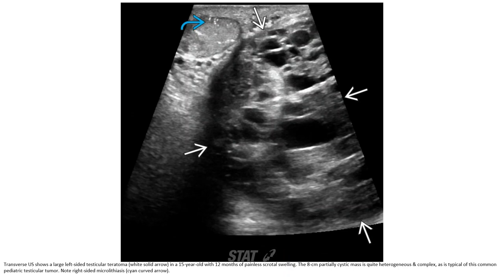This ultrasound shows a large lobulated testicular mass in a 15-year-old with 12 months of painless scrotal swelling. The mass is quite heterogeneous and complex, which is typical of this common pediatric testicular tumor — a teratoma. Note also right-side microlithiasis.